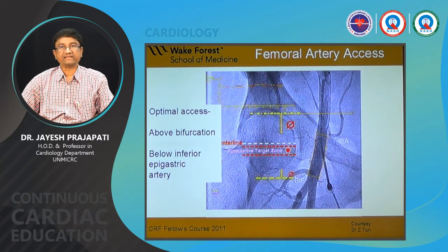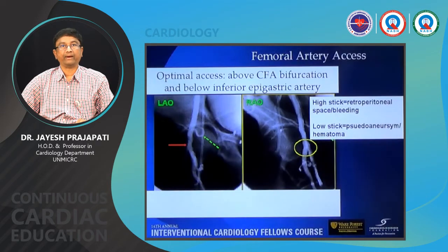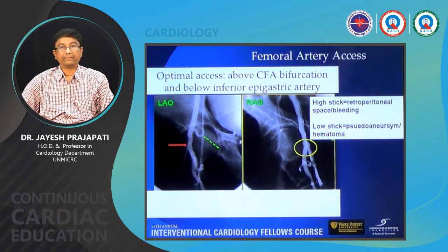Don't do a hurried puncture, otherwise the patient will move his limb, or take a deep inspiration with the abdomen, and sometimes your puncture moves here and there, and your life will become miserable. So take some time, keep the common position in mind, and after giving the local anesthesia, with the 18 gauge needle, keep the bevel upwards at 45 degrees.